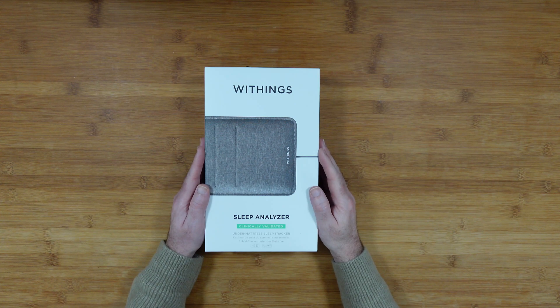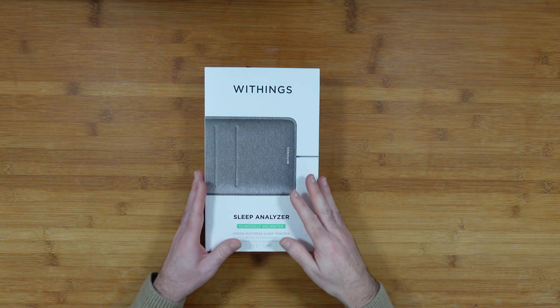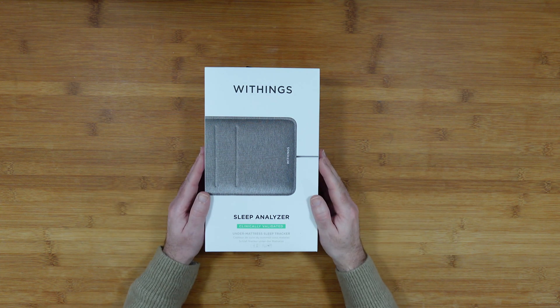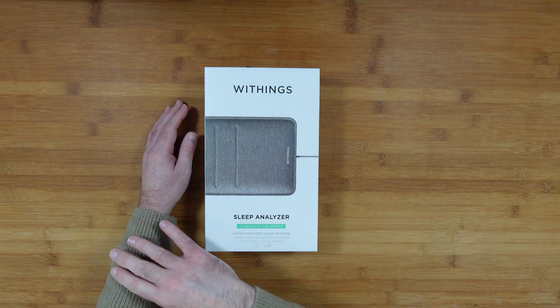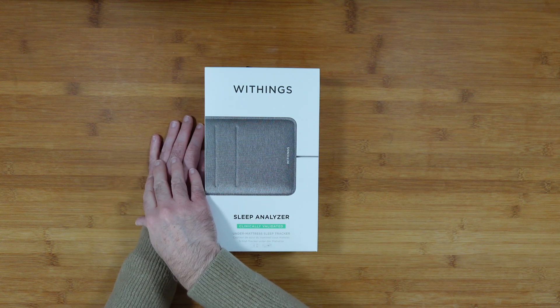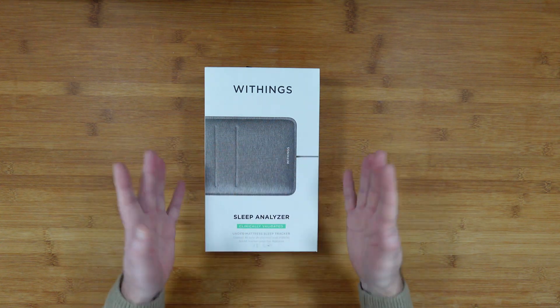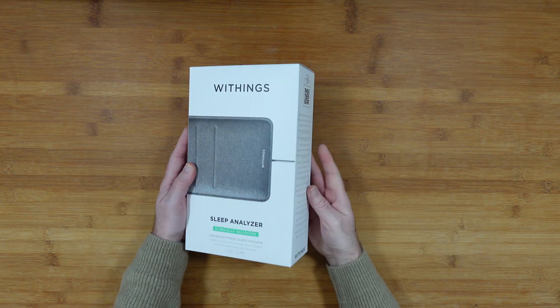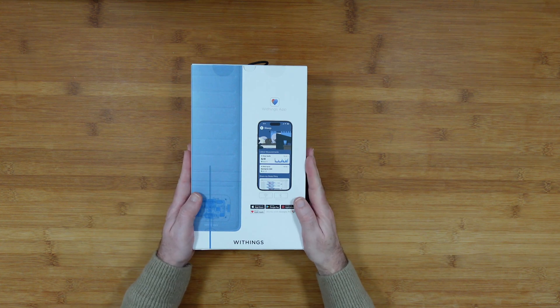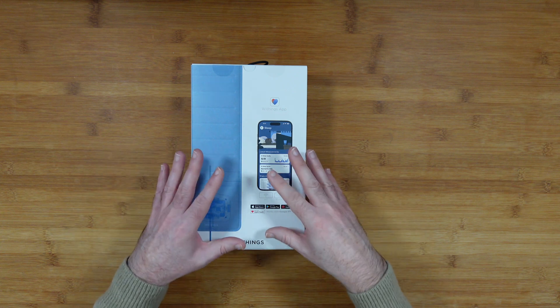A little background: I'm really interested in this product because I like to keep track of my health and sleep, but I don't get on very well with a wrist-based sleep or fitness tracker — it just bothers me at night. I'm going to be trying a smart ring at some stage, but this is really unobtrusive because you don't have to wear anything; it sits simply underneath your mattress. In the first half of this video I'll be unboxing the product, and in the second half I'll share my opinion and experience after a couple of weeks.